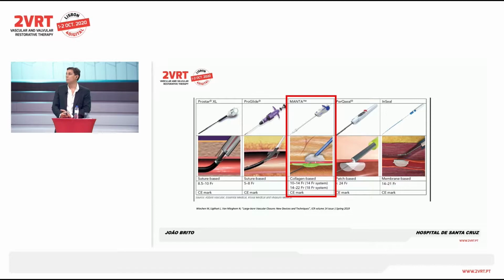But we have a different approach for the closure of large bore vessels, which is the Manta, which is a collagen-based system. We have two different devices for different sizes. The Manta 14 French, which is able to close 10 to 14 French sheath insertion, but the outer diameter of the sheath may go to 18 French for the 14 French device.